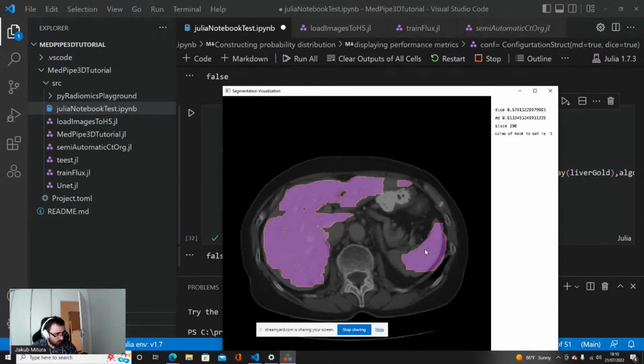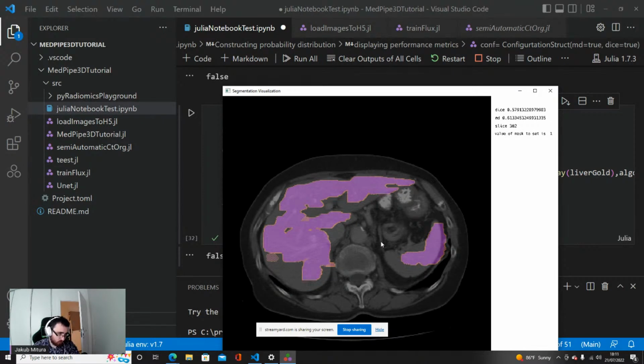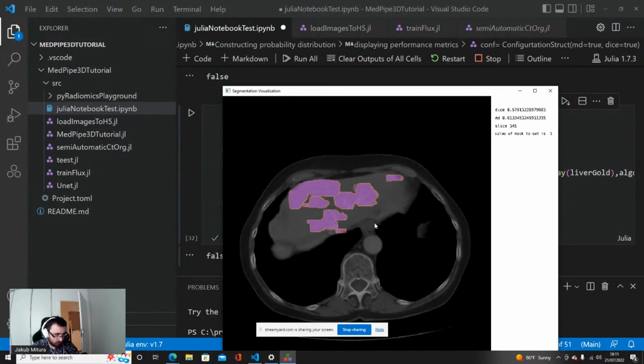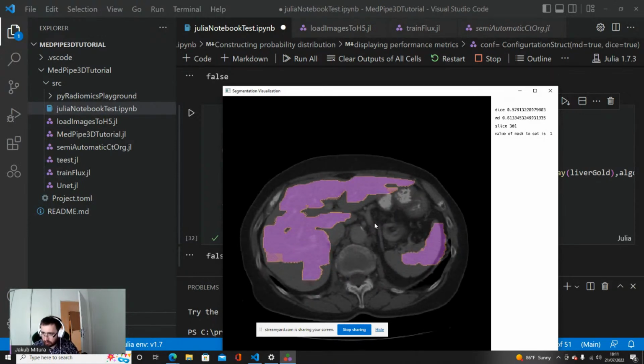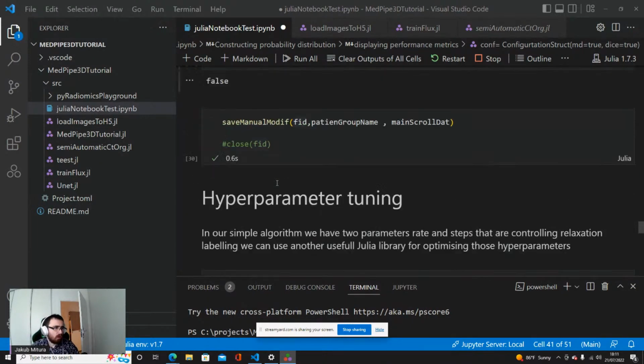What is important, the values will be different, because these are different scores. In the case of the spleen, your performance will be far worse. Why? Because when you are executing around the spleen, all of the liver would be the error. When you are executing from the liver, all of the spleen is the error, and the spleen is far smaller. As I said, it can look very bad, do not be afraid of it. The spleen dataset is far smaller, so that's why it was also posted in the link, and this also works.